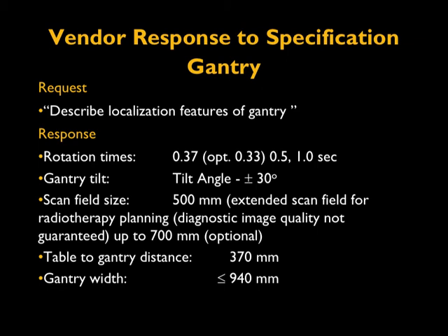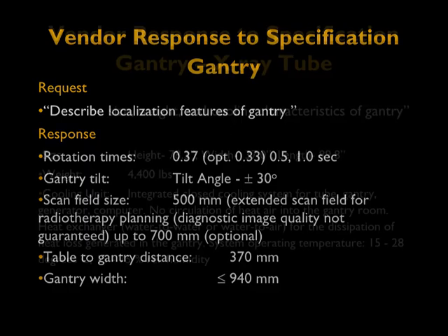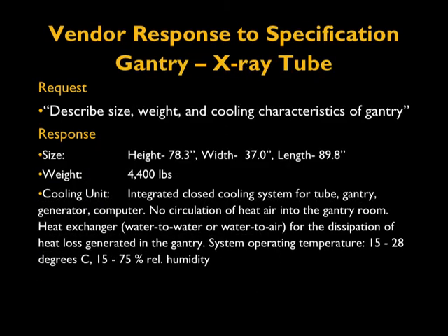This response for a particular request allows the team in the clinic to compare different manufacturers and helps in the process of picking the right scanner. Here is another request regarding the gantry X-ray tube. The request is to describe the size, weight, and cooling characteristics of the gantry.